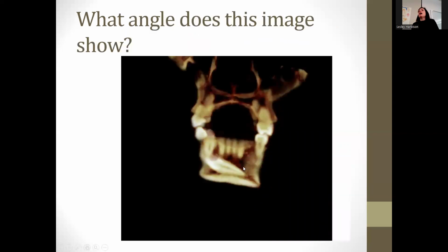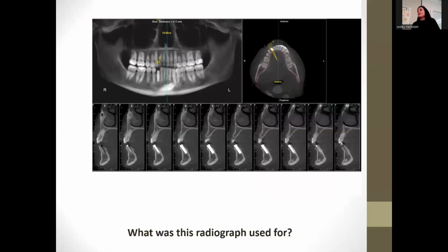So here's another image where everything out of the field of view, you can't see, so they move it into a plane where they're just looking at a certain part of the anterior portion of the face, right through the chin area, to see this canine, which looks massive and these teeth look tiny. Obviously these are mandibular anteriors, and this is a gigantic looking canine. So I don't really understand the size of it all, but that's what the image is.